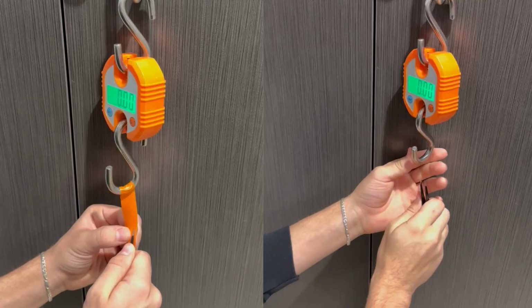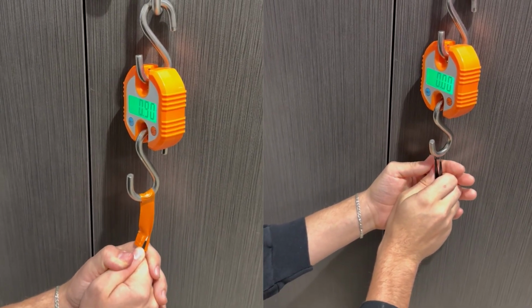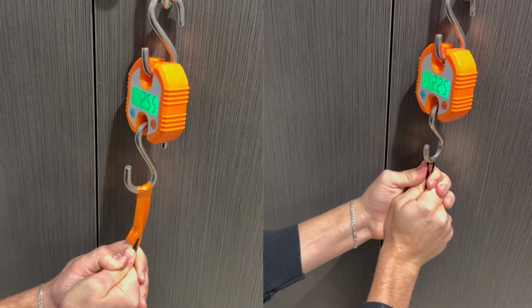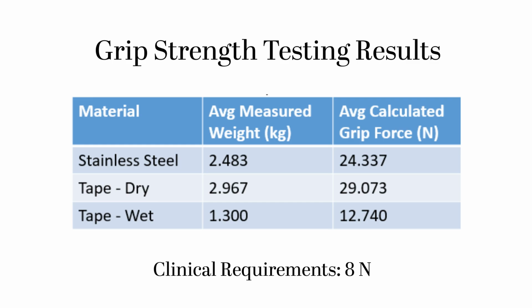The second clinical requirement for these forceps was a grip strength greater than 8 newtons. We measured this by pulling on dry and wet tape as well as just the stainless steel that was attached to a hanging weight scale. The values were measured when the forceps slipped and then converted to newtons to represent peak grip strength. As shown by the table, both the dry materials had relatively high values and passed our test extremely well. The wet material had a slightly lower grip strength as expected, but passed either way.